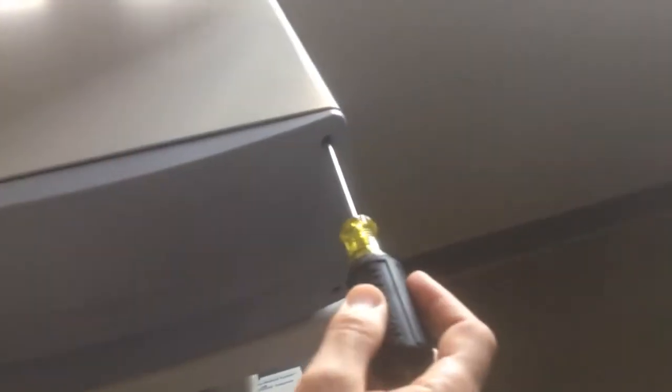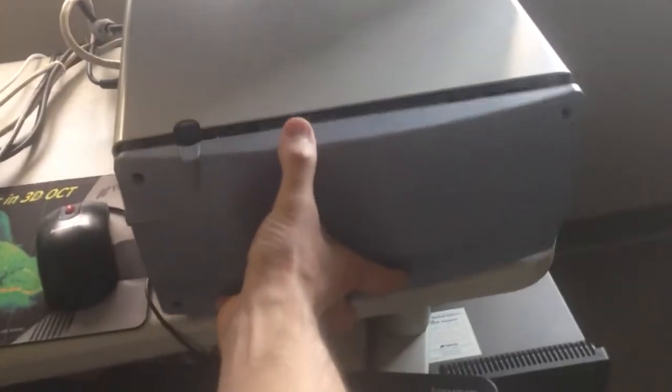One, two, three, and four. Once those are removed, this front plate will come right off.